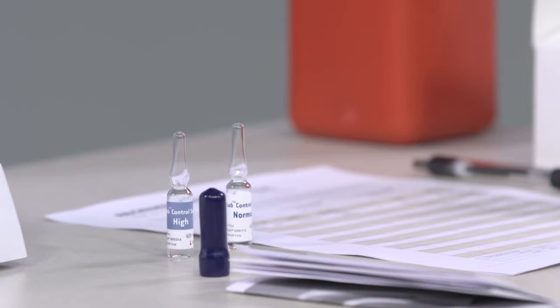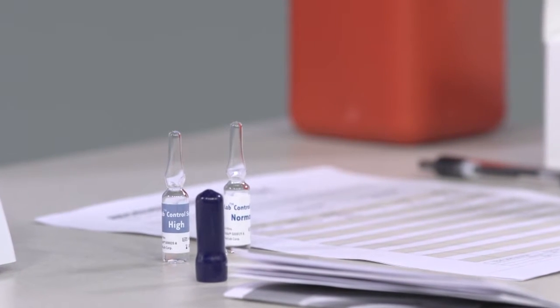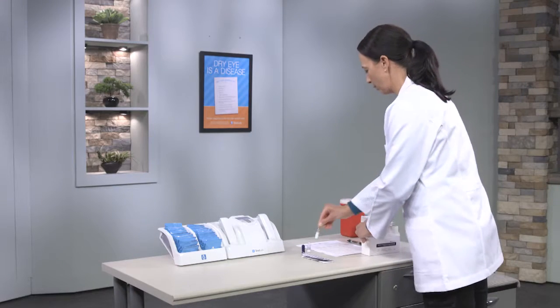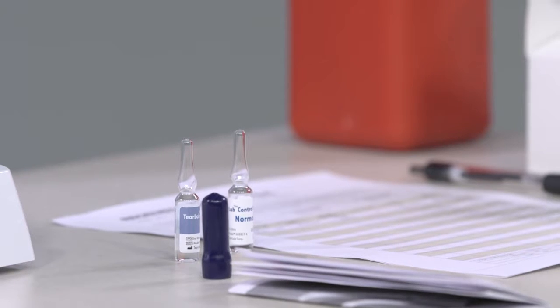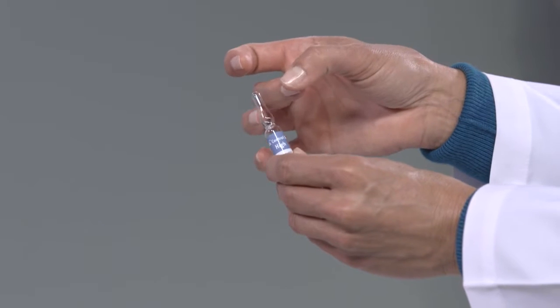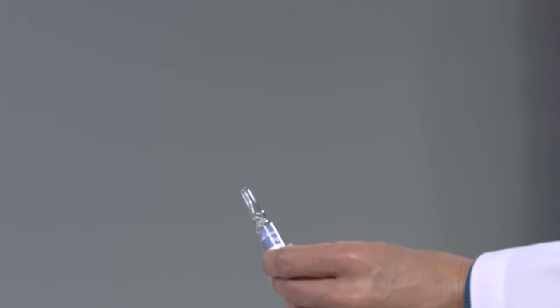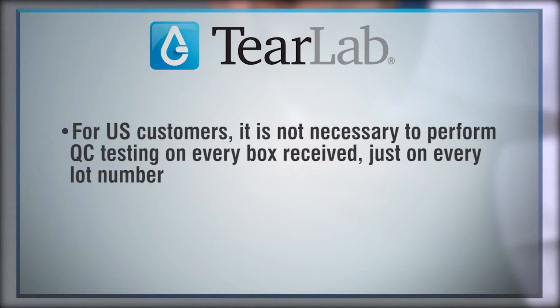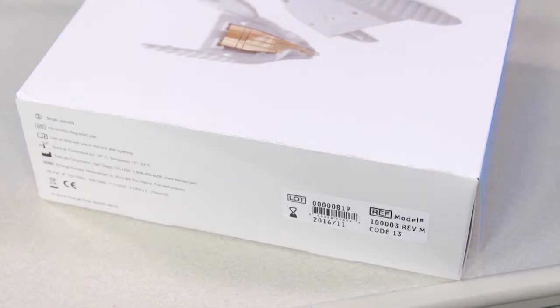The liquid control solutions test the total TearLab system, including the hardware, the software, the testing environment, and the user. You should always test control solutions when you purchase and receive new test cards, or to determine if temperature fluctuation is affecting test results. For U.S. customers, it is not necessary to perform QC testing on every box received, just on every lot number. The lot numbers are printed on a label on the outside of each box of test cards.